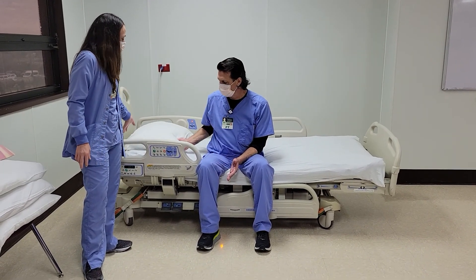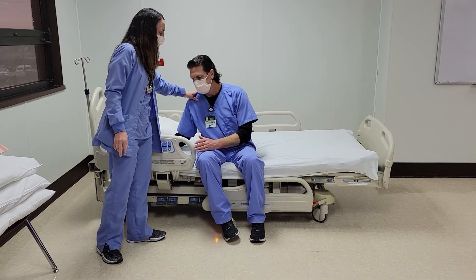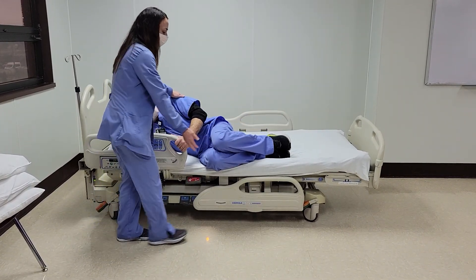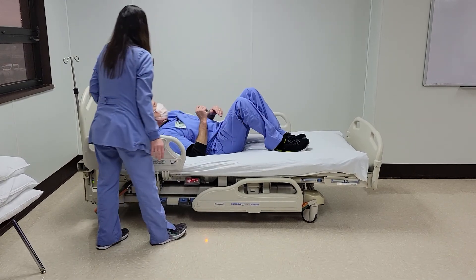For Steve to lay down, he's going to go on to his side, grab the rails, pick up his feet, and then he can keep his feet bent and roll to his back.